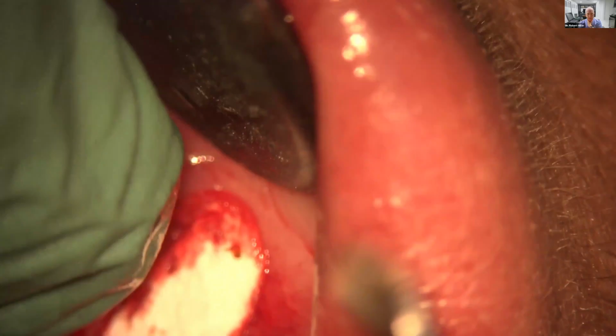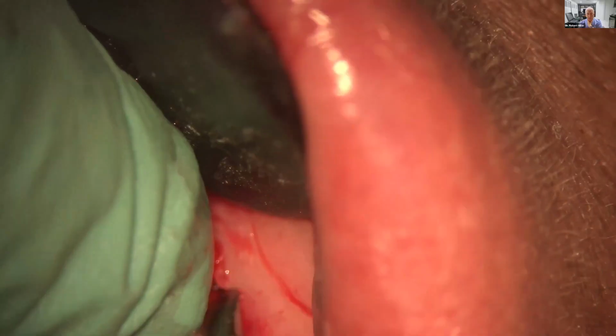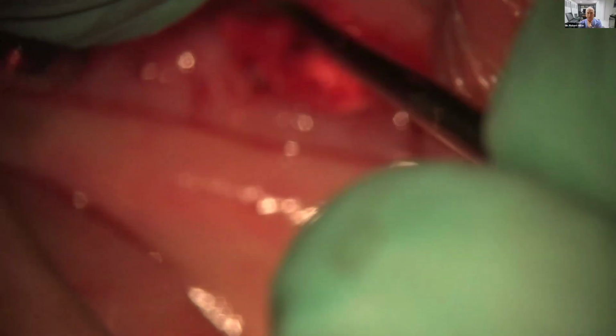and then suture this. And in a lot of these cases, we could even get primary closure of this, which is amazing to me. But you do want to tuck this underneath the flap margins.